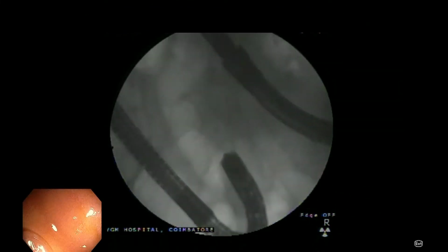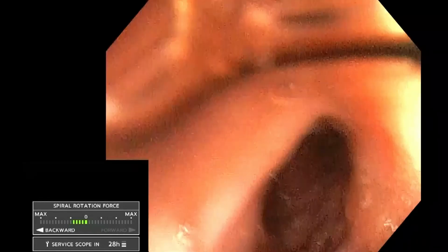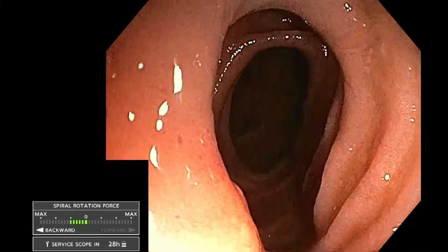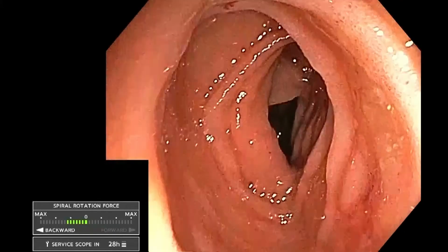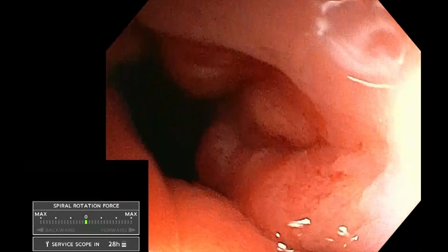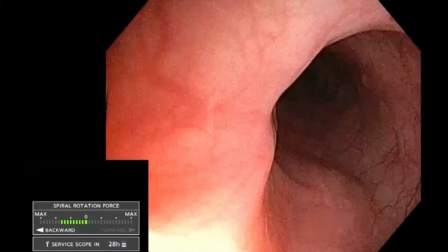This was shot 10 minutes before we entered the cecum. Now you can see the enteroscope entering the cecum through the IC valve. This completes the anterograde examination. Withdrawal of the scope is done by pressing the backward pedal. There is controlled unpleating of the bowel which helps us to target any lesions required. Care is taken that the 80 cm mark is maintained until the tip of the scope exits the pylorus. Again, while reaching the cricopharynx, the neck of the patient is kept extended and gentle spiral rotation is used as the scope exits outside.